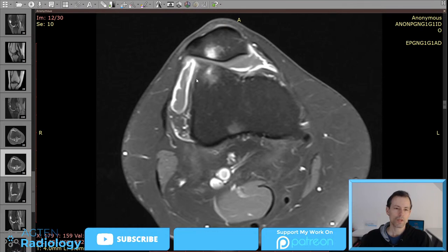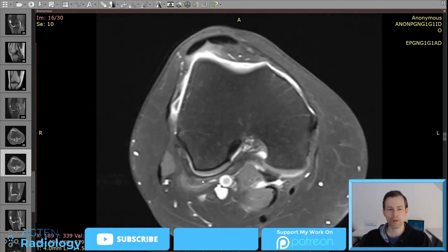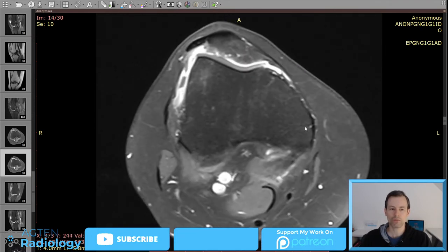arthritis? So we can't be 100% sure. One thing I would like to say, first of all, we would need more clinical information to really be sure. And second, we normally don't give gadolinium intravenously for standard knees. So we don't really have a good understanding of a just 40-year-old knee. How such a knee behaves if there is irritation, if there is osteoarthritis, whether they have synovial enhancement or not. We simply don't give gadolinium enough to really get this experience.